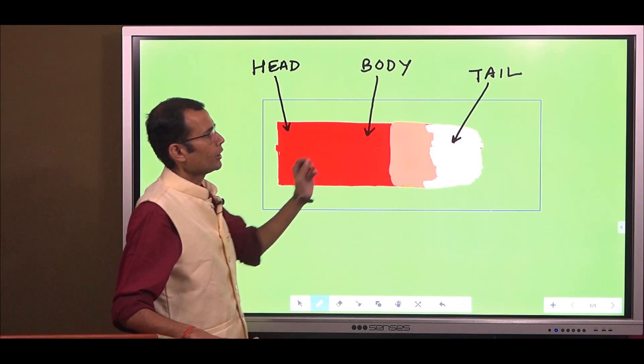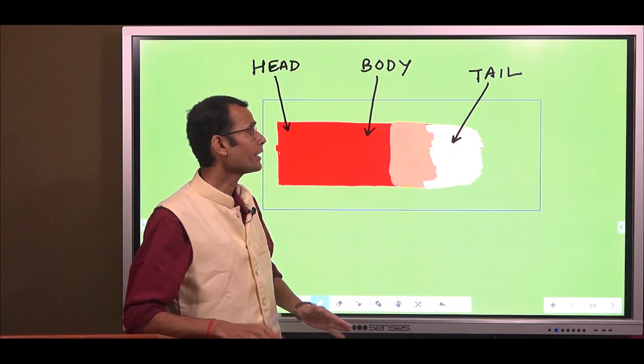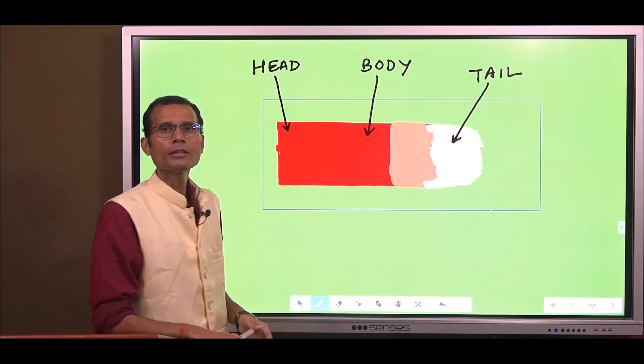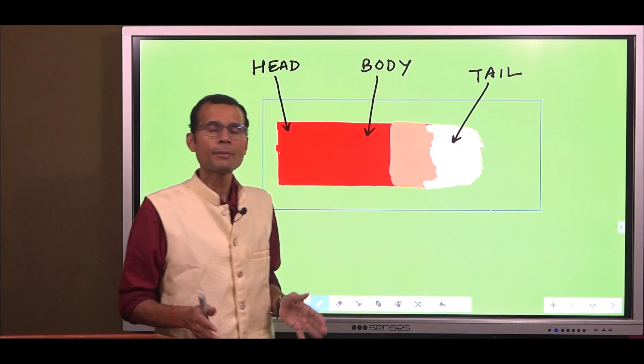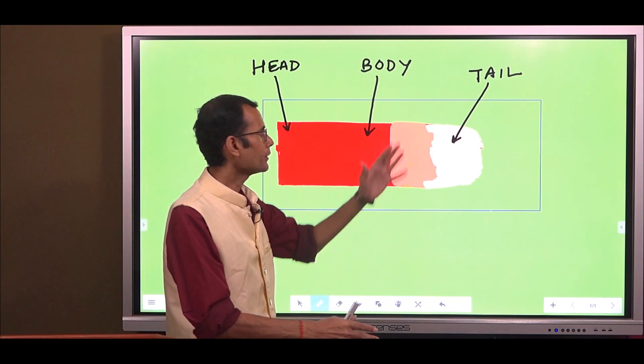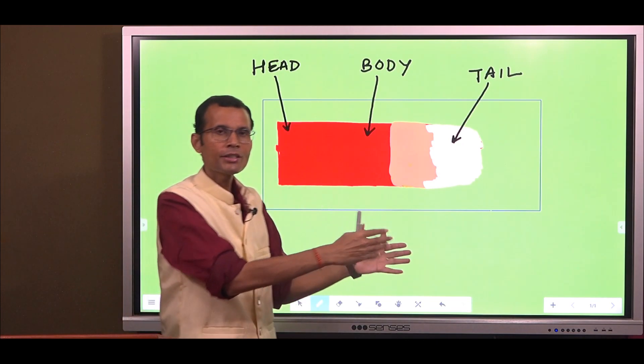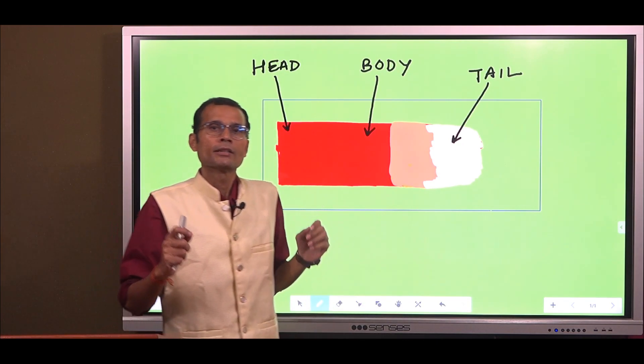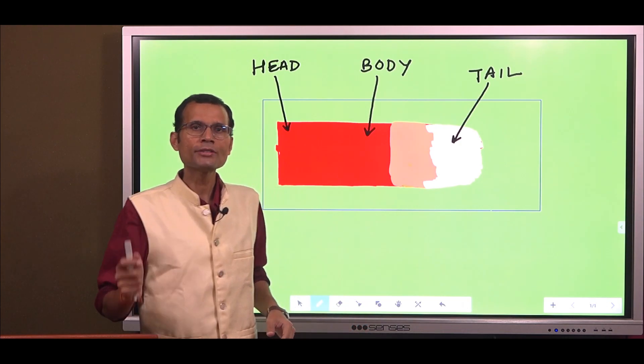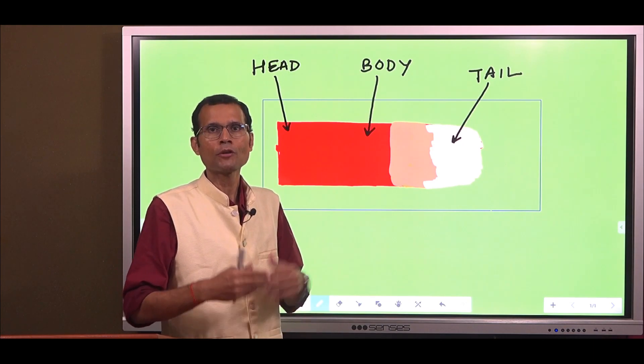So neutrophil and monocyte mainly predominantly in the tail region, then body region mainly the lymphocytes, and I'm saying predominantly these cells are found in those particular regions. The remaining cells toward the head region. The next question is why is it so? Why do you see such an uneven distribution or non-uniform distribution of cells?